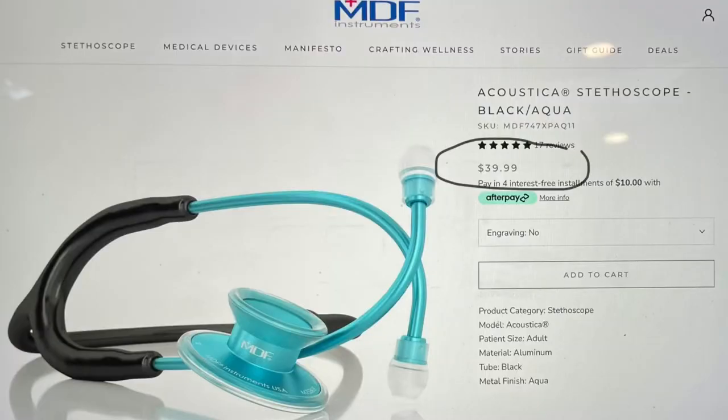So now let's talk about the pricing. For this series of stethoscope, which is the Acoustica, the pricing depends on the color that you would pick. For this one, it's aqua blue and black. I got this for $39.99 and I purchased it from Amazon because it has free shipping. Now, if you go to their website, you will get a 10% off.